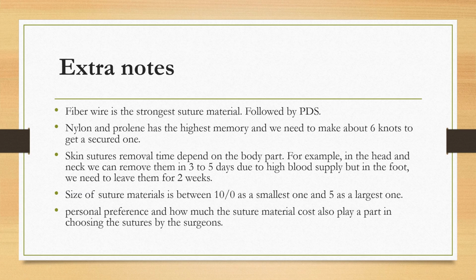Skin suture material removal. If we need to remove the skin sutures, if we use, let's say, a non-absorbable thing to suture the skin, and we need to remove it later, how long do we have to wait to remove the suture? This depends on the body parts.